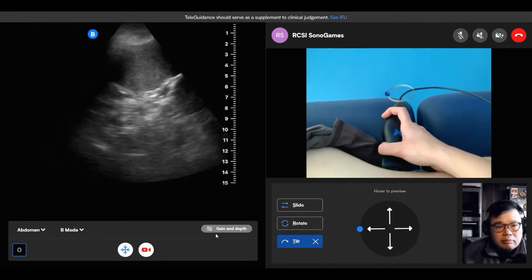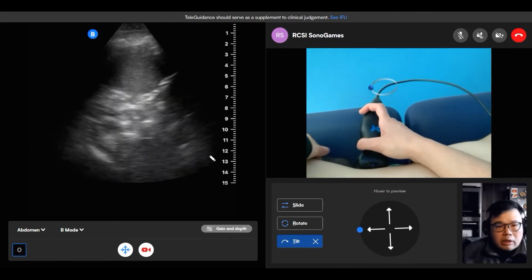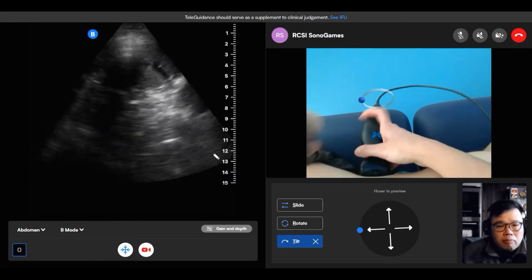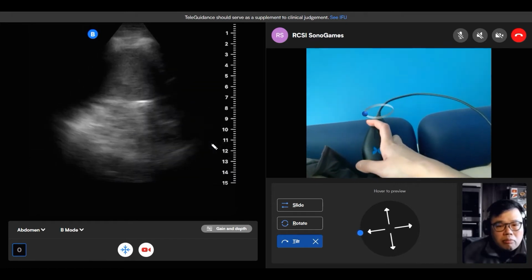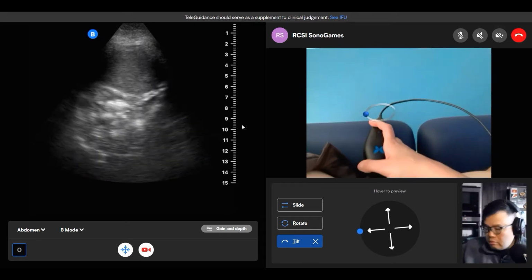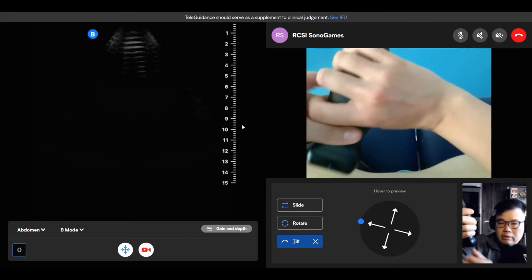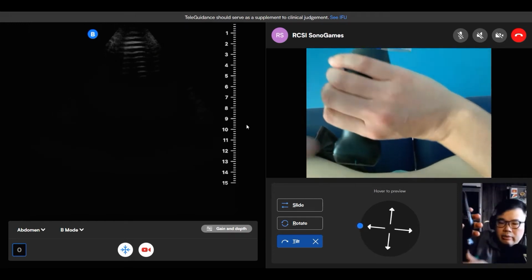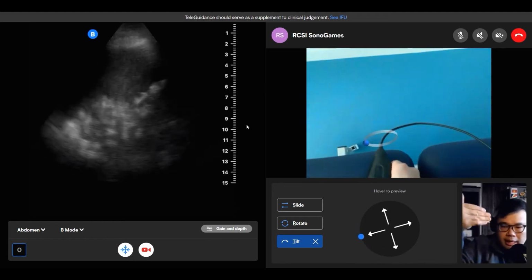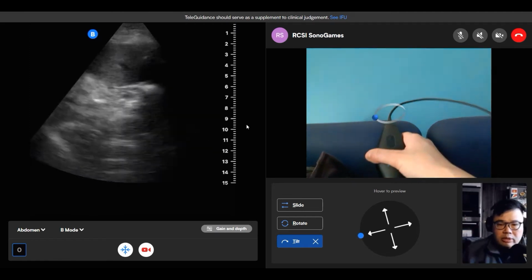Finding that view very difficult. Could I get you to tilt towards me? No, don't get him to tilt. No, so literally put your hand into the bed. Like I'm at the bed right now. So if you can see me, you can hold the probe like this. Oh no, sorry, the other way. Exactly, and then the back of your finger should be on the bed, and you should be pushing almost into the bed.